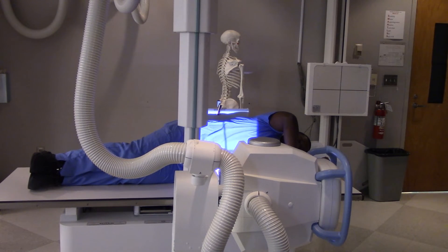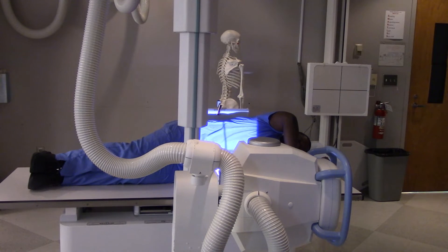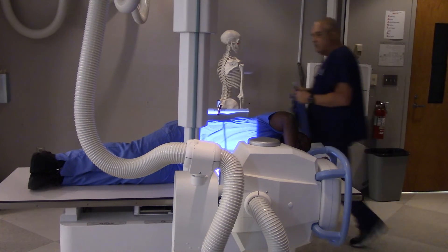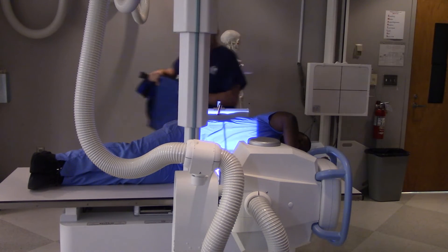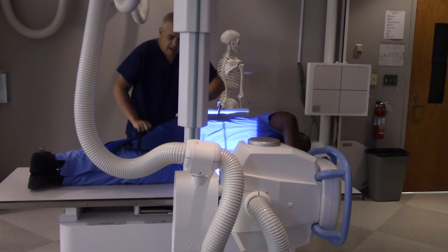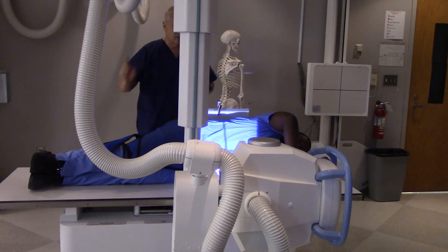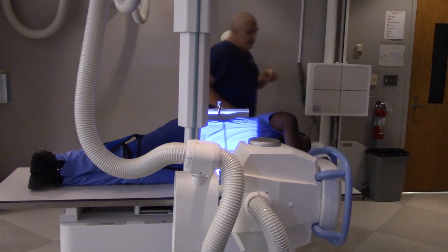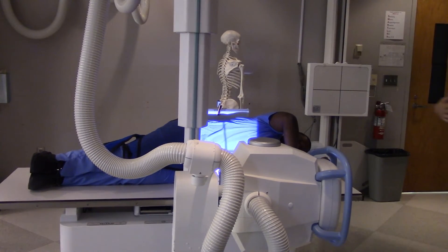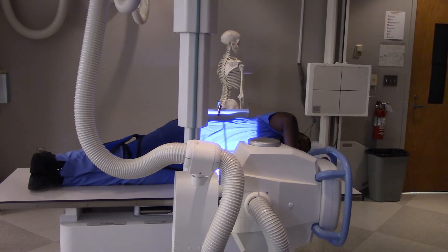Can I shield this man's gonads? Yes, I can. The gonads are down below my area of interest, so I can safely put a shield on without worrying about that shield getting in my image.